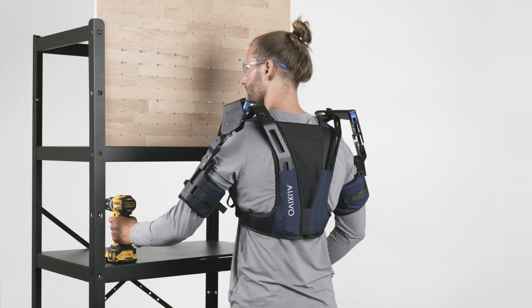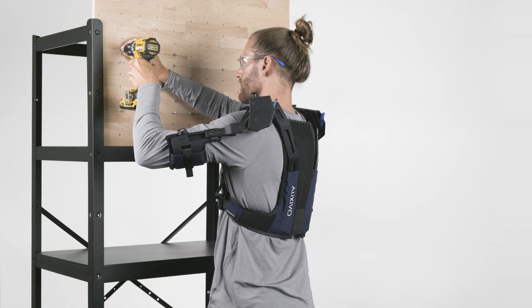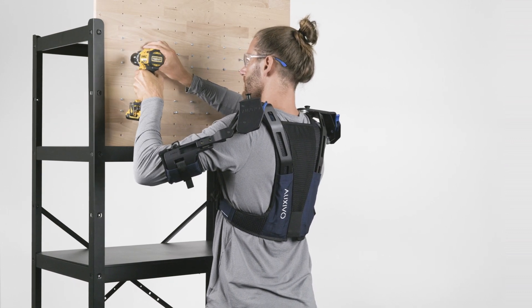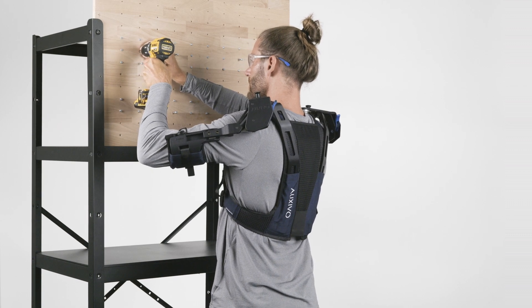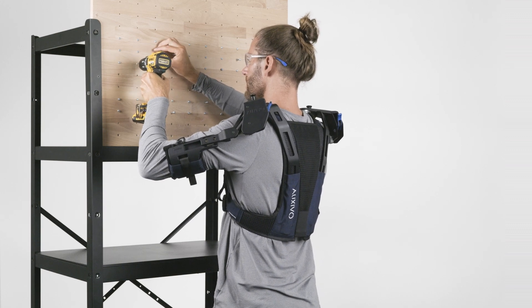When you start using the DeltaSuit, your work will feel somewhat different. Therefore, we advise that you take some time to get used to it. Work with it for a maximum of one hour during the first day, and then increase the time step by step until it feels completely natural to wear it all day.